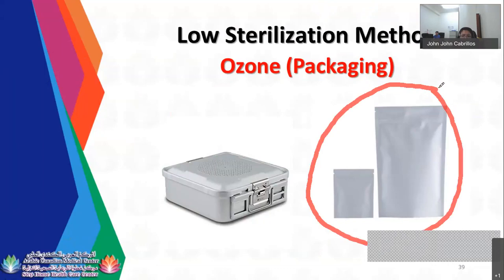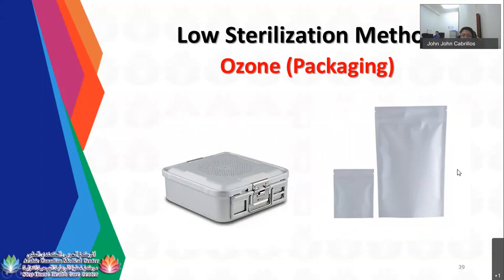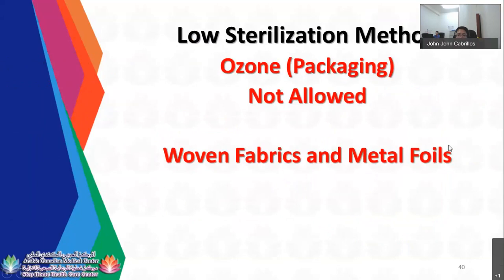Okay. For this one, this is aluminum. So you need to check if the rigid container or the aluminum foil packages is compatible with ozone. So not allowed are your woven fabrics and metal foils.